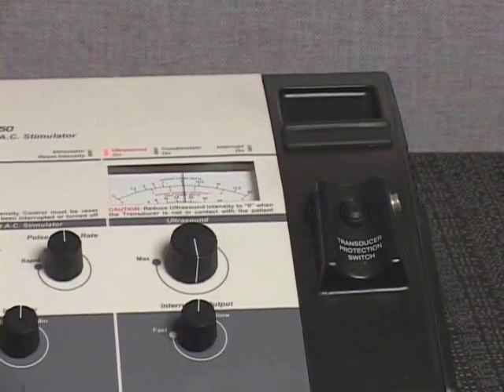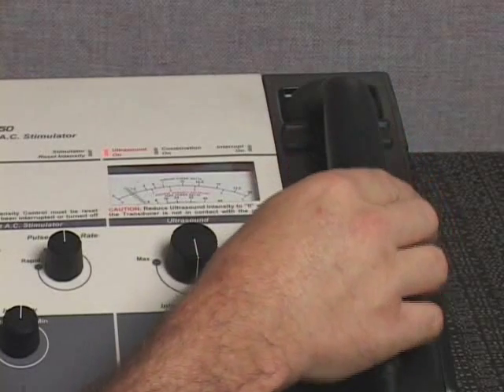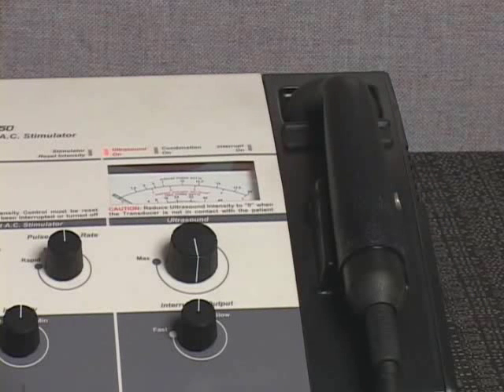The transducer protection switch, located on the transducer cradle, will shut off ultrasound output from the transducer when the transducer handle is placed in the cradle during treatment. This will protect the crystal, located in the transducer faceplate, from overheating when it is not in contact with the patient.